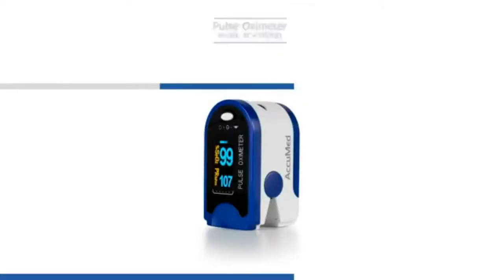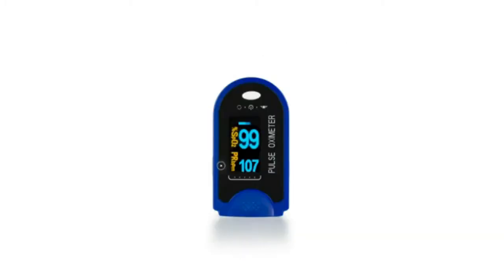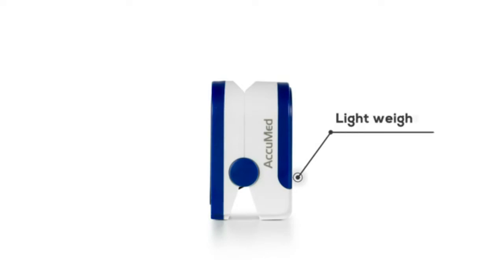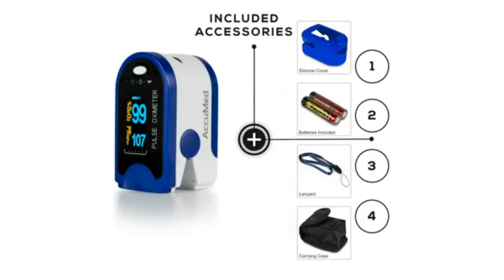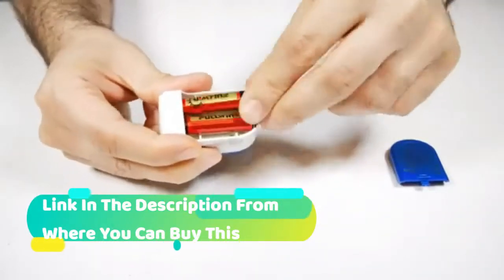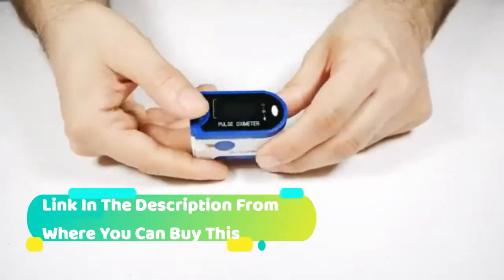AccuMed Fingertip Pulse Oximeter, SP02 Finger Blood Pulse Oxygen Monitor with carrying case, lanyard, silicon case, and battery — CMS50D. Accurate oxygen saturation and pulse rate readings in one device. The fingertip pulse oximeter fits all finger sizes from kids above 4 years old to adults, measuring the level of oxygen in the blood and reading pulse rate in just 8 to 10 seconds. It is crucial to use the device in a stationary position and not while in motion for precise readings.